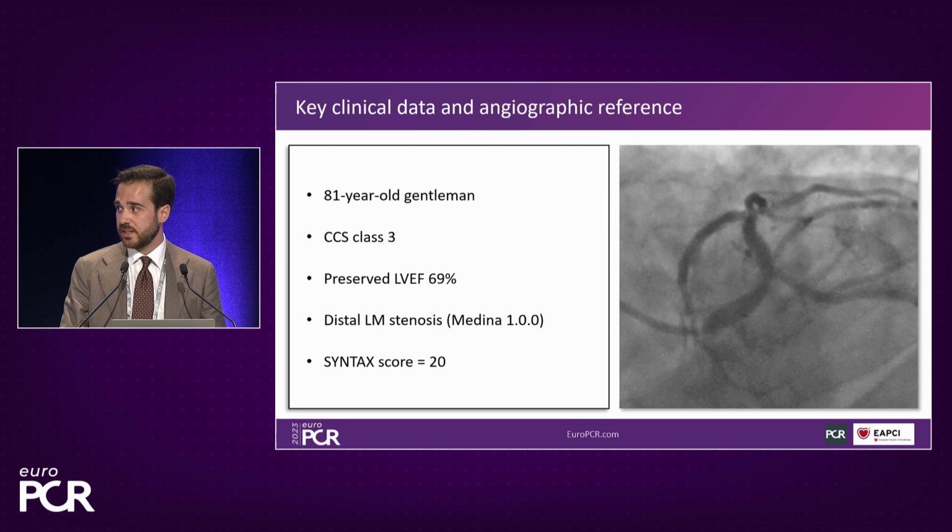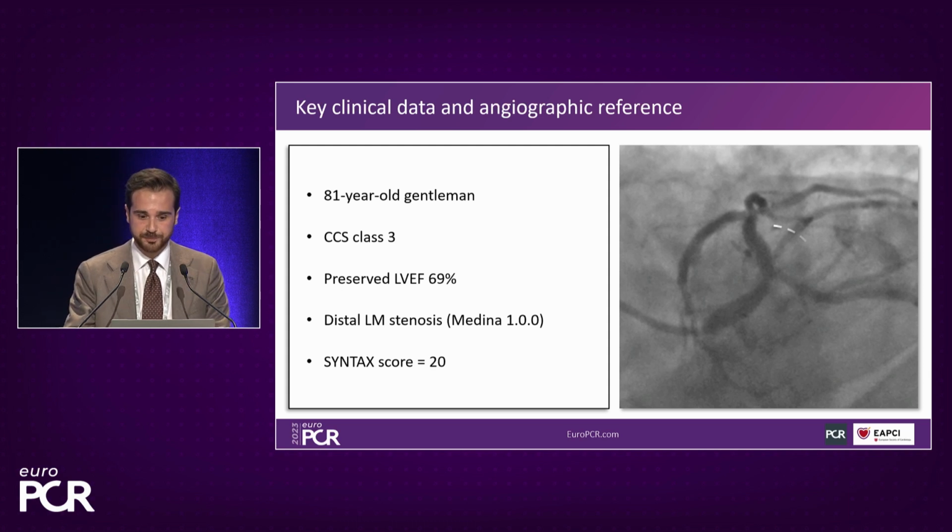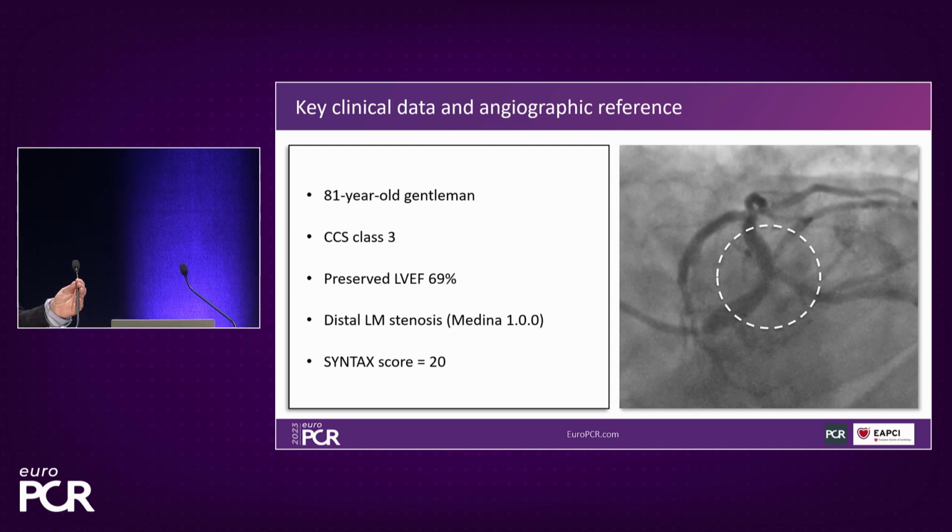So based on these findings, we kindly ask Professor Serruys and his team in Galway to assist us with multi-slice computed tomography analysis. Thank you, Alessandro. We will have now John Tsai from Galway, which is going to review for you and for us the multi-slice CT scan of this case.